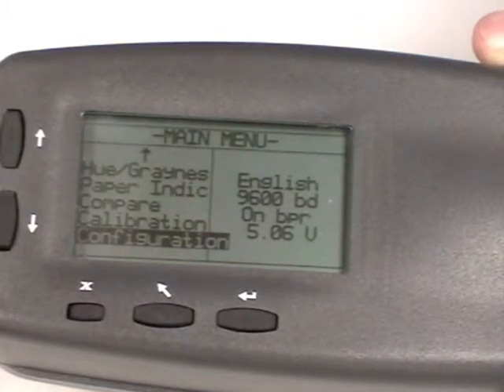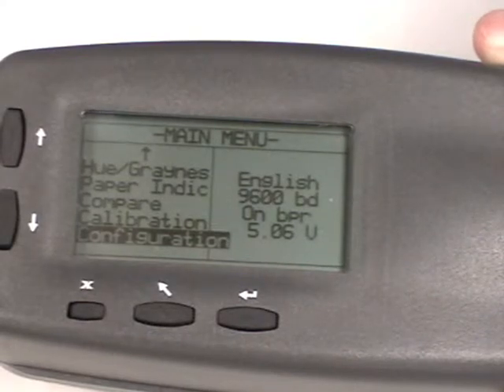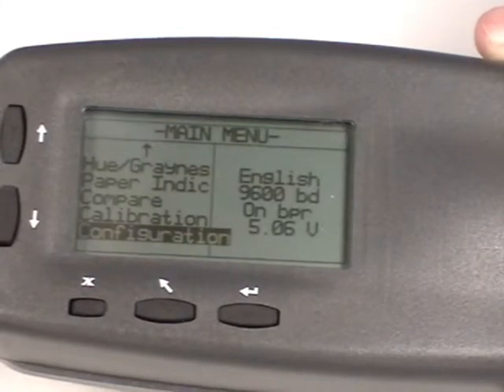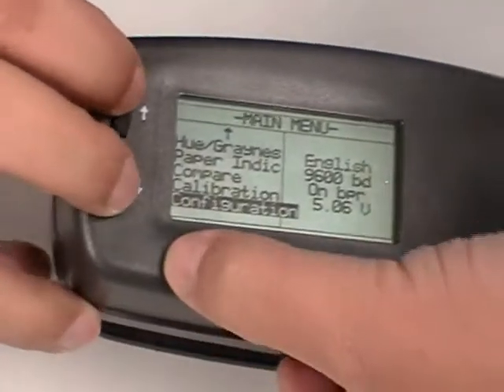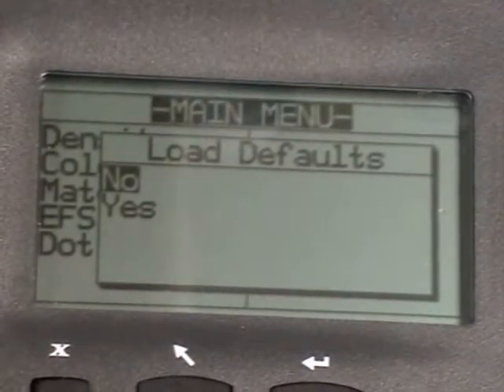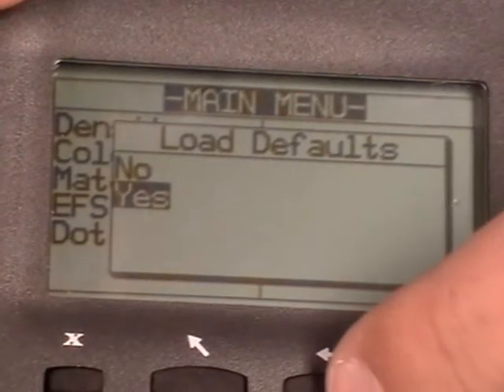If all three of the lamps are on and your battery voltage is set, something might be happening with some of the settings. What we can do is a master reset. To do a master reset, press the up arrow, the down arrow, and the X all at the same time. Press them down, hold, and then release. After a second, your screen should flash back up asking if you want to load defaults. Scroll down to highlight Yes and press the Enter key.